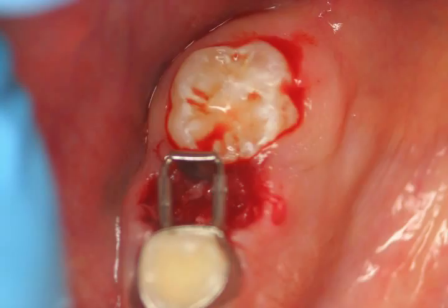This photo is showing the distal shoe space maintainer placed in the mouth. Notice the ring or band portion glued around the tooth in front of the one removed, and the shoe part of the space maintainer next to the permanent molar to guide it into the mouth more correctly.